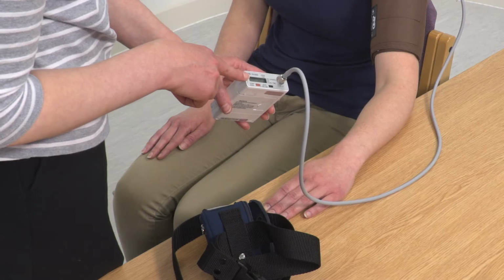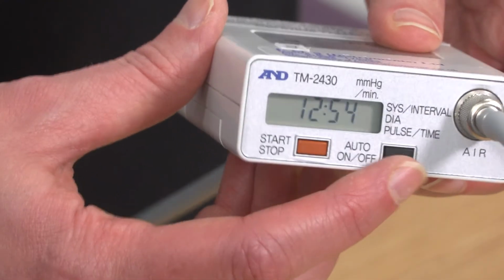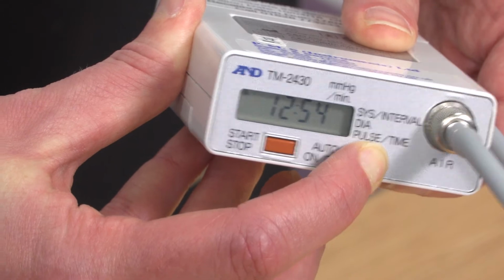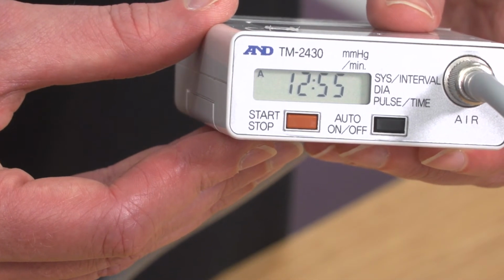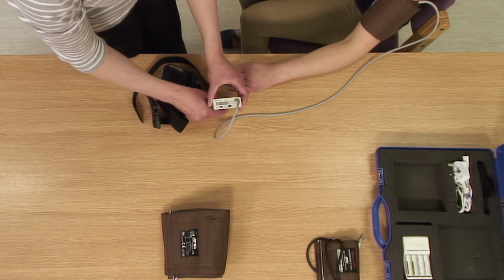Turn the recorder onto automatic mode by pressing and holding the black Auto On-Off button for about 3 seconds. Once switched on, the patient should not need to do anything else to the recorder. All readings are stored. The letter A will appear in the top left-hand corner of the display.